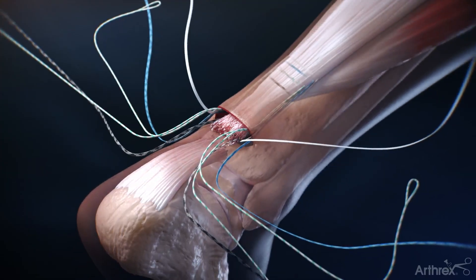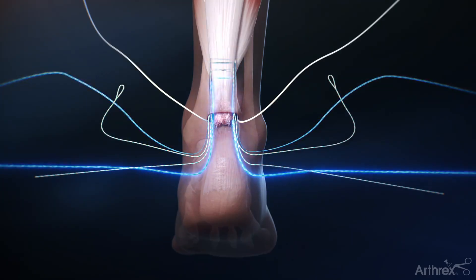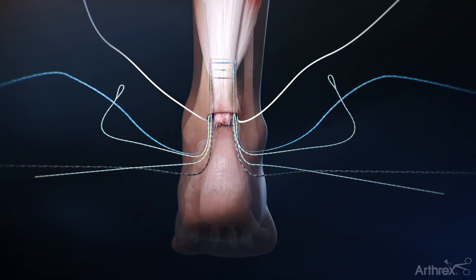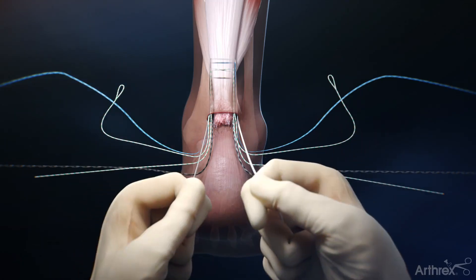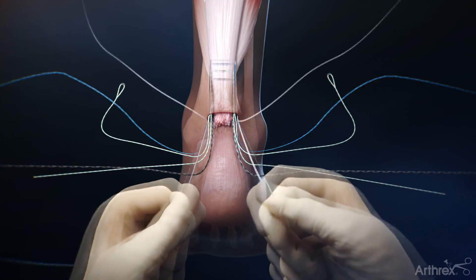Separate out each of the five sutures — the white, blue, and black suture tapes, as well as the two green and white fiberlink sutures. Each suture should be tested by pulling light tension through ten cycles to confirm appropriate hold in the tissue.